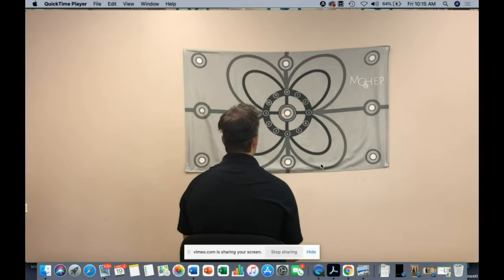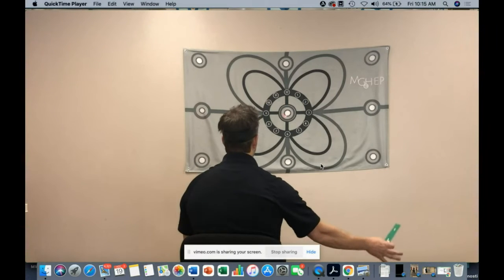with speed into a certain area based on maybe some math skills or a sequence of numbers. So if I say what's 2 plus 2, they'd have to move to the 4. What's 9 minus 6, they'd have to move to the 3. If I say 3, 8, 7, move to the second number that I mentioned. So there's some short-term memory recall. They'd have to move to the 8, and they just have to compute these things. So depending on the effect of CVA or some stroke or traumatic brain injury, that might be effective.